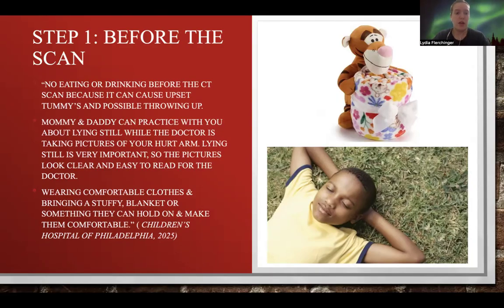And then your mommy and daddy can help you practice lying still, like on the floor or your bed, while the x-ray technician, whose job is to take the pictures of your hurt arm, works. So lying very still is important. So you can practice lying still anywhere. Also wear comfortable clothes, like your pajamas, gym shorts, or a comfortable shirt. And also you can bring a stuffed animal or a blanket to make you feel cozy and comfortable.